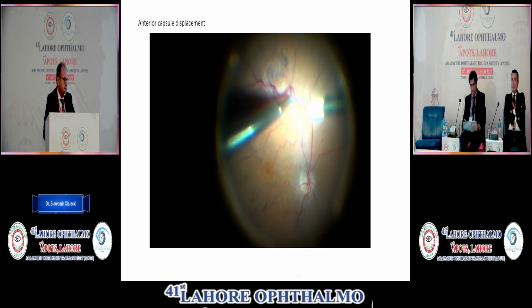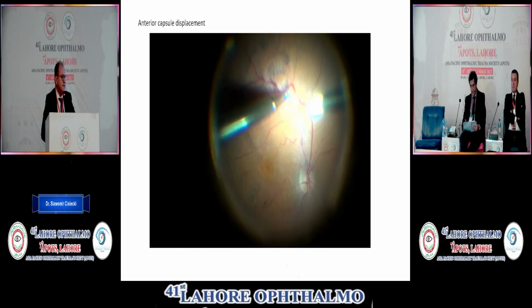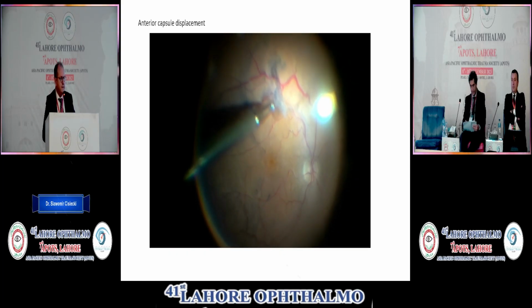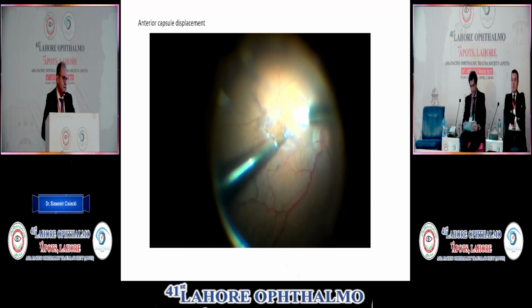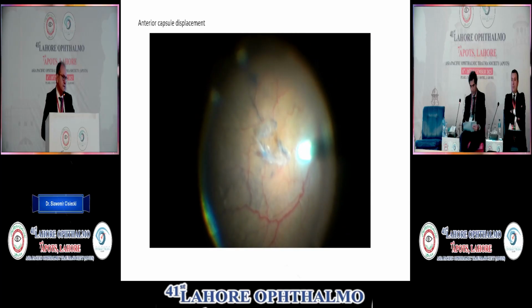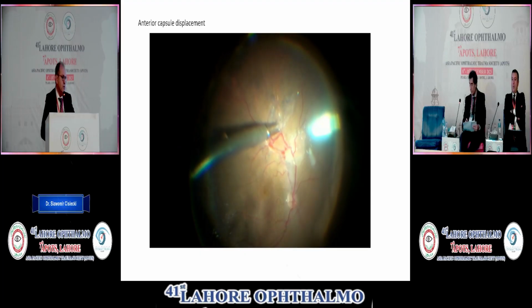So I decided to go once again. And you can see, this is the anterior capsule. Actually, it's so tight, it behaves like a PVR membrane. And this was also the reason that it was my first and last time using the anterior capsule to close the hole.